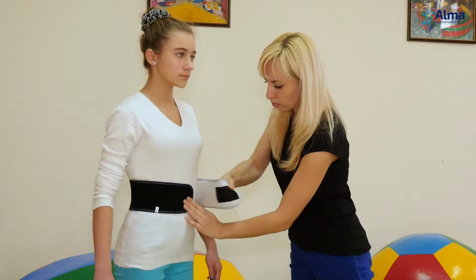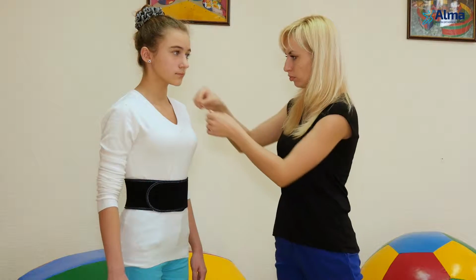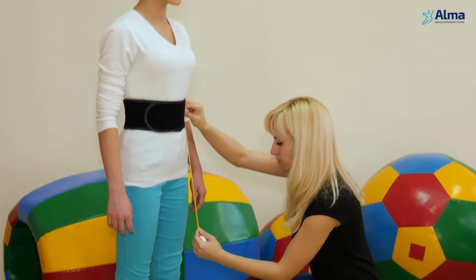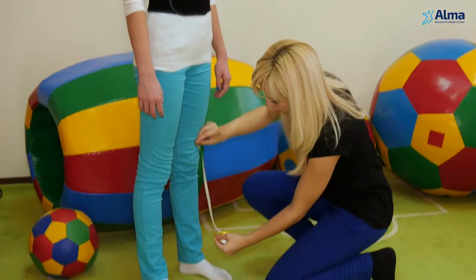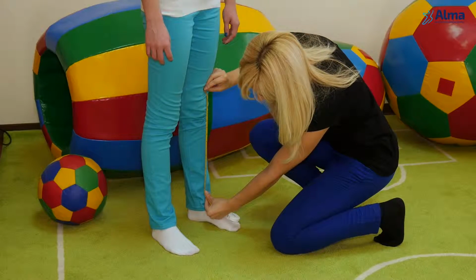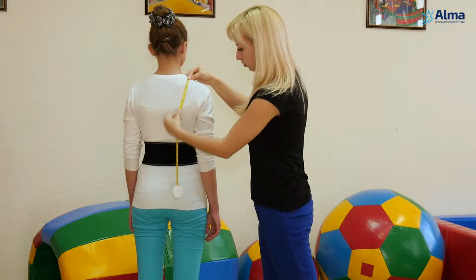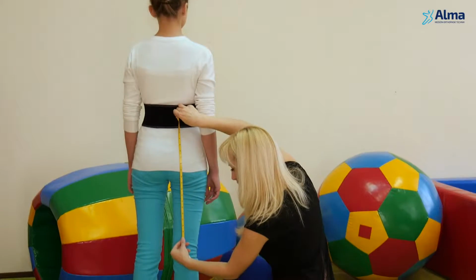To take accurate measures, mark the waist with a belt. Dimension A is measured from the center of shoulder girdle to the belt center. Dimension B is measured from the belt center to the horizontal line 3-4 cm above patella. Dimension C is measured from the horizontal line 3-4 cm above patella to the defined line 2-3 cm above ankle. Specify obtaining data in the corresponding fields of the order form.